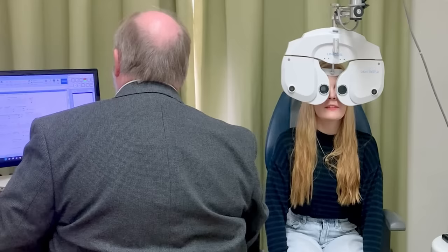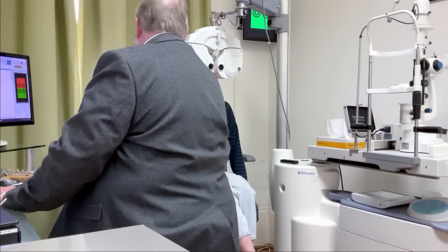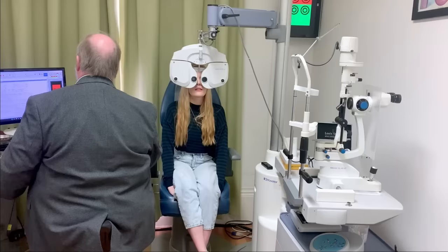Oh, it's so clear. Can you see my reds and greens again? Yeah. Which one this time stands out better? Red. Red a little bit, okay. And with this one? Green. Lovely. Red. Red one a bit? Yeah. Okay, let's go back to my letters.